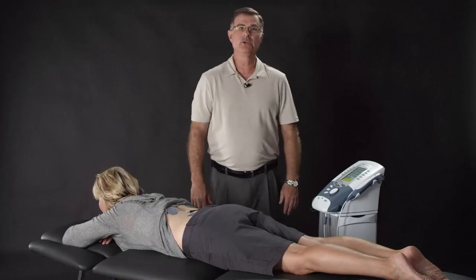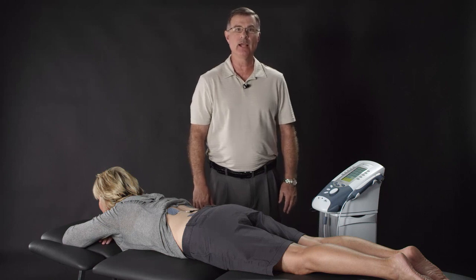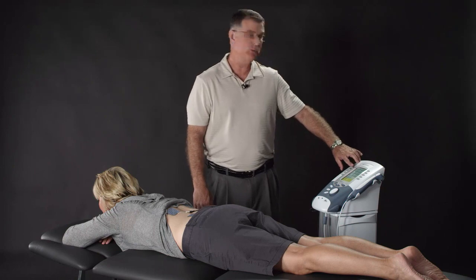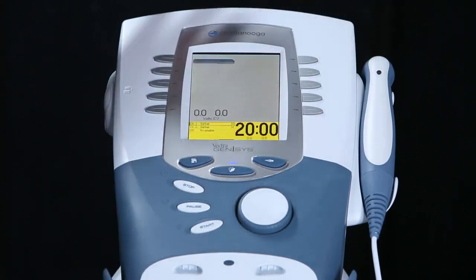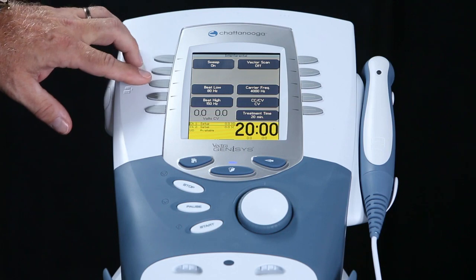With the Vector Genesis, you have the ability to save 200 protocols that can be retrieved at a later time. In order to save protocols, the first thing we'll do is press the electrotherapy key, then we'll press the interferential key, then the edit key, and we will adjust our parameters. Let's create an opiate release protocol.